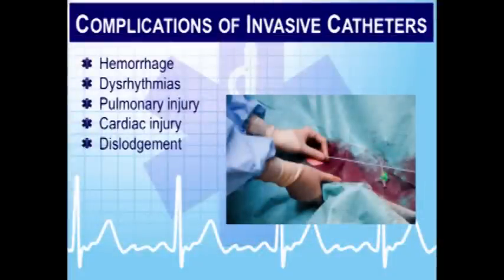So there's a variety of different catheters that we can use. We can use arterial catheters, we can use central venous lines, and then we can also introduce a catheter that goes all the way through the heart into the pulmonary artery. Obviously, this is dangerous, right? We've got these big, huge catheters sitting in arterial blood vessels under high arterial pressure. So if that line became disconnected from that transducer, patients can bleed out in a matter of 5-10 minutes, depending on what catheter we're talking about. All right, so they are dangerous. They can cause hemorrhage.